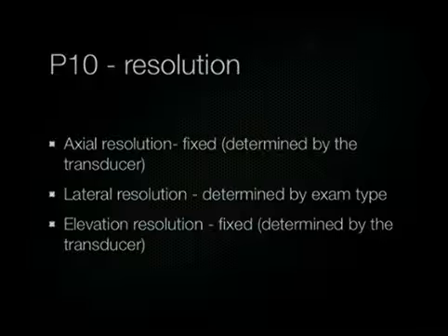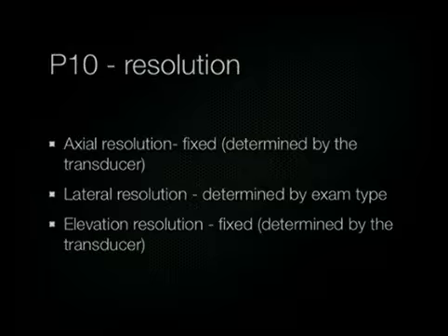For example, an abdominal exam evaluating deeper structures will set the lateral resolution or the focus for a greater depth than for a superficial examination. Elevation resolution, which determines the thickness of the ultrasound slice, is fixed and is determined in the design of the transducer.